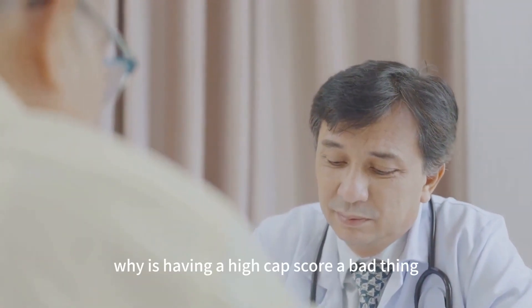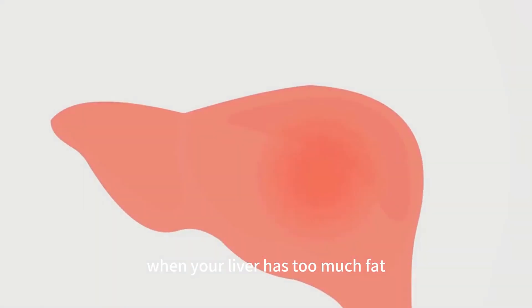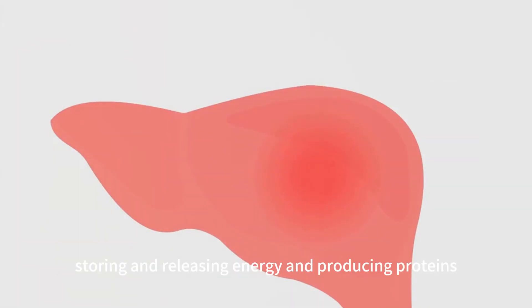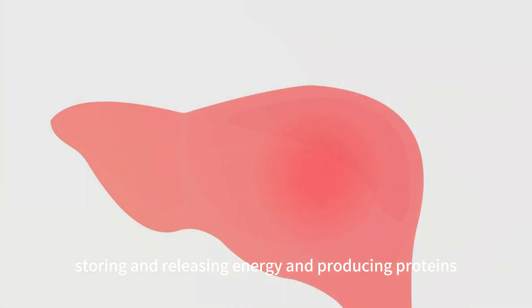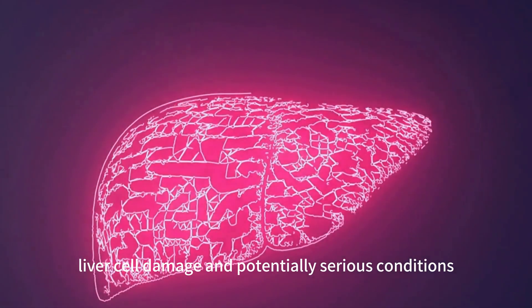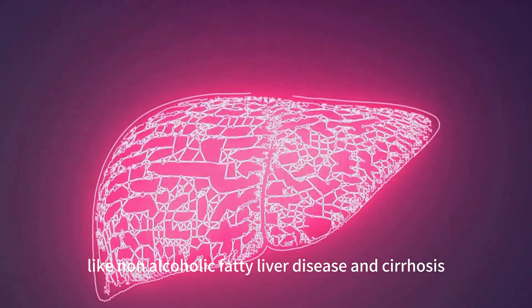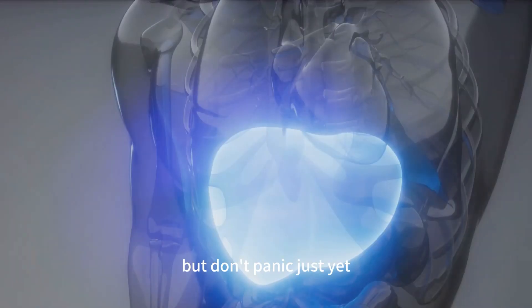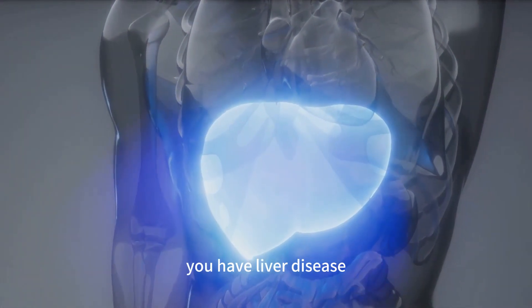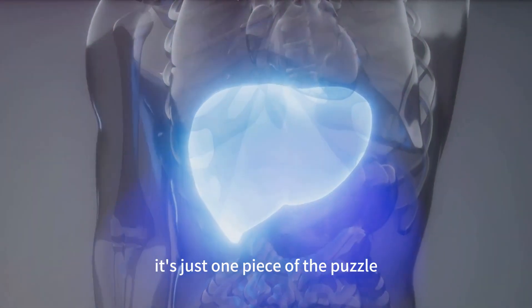Now, you might be wondering, why is having a high CAP score a bad thing? When your liver has too much fat, it's like an overworked factory — it struggles to perform its functions like filtering toxins from your blood, storing and releasing energy, and producing proteins. Over time, this can lead to inflammation, liver cell damage, and potentially serious conditions like non-alcoholic fatty liver disease and cirrhosis. But don't panic just yet — a high CAP score doesn't automatically mean you have liver disease. It's just one piece of the puzzle.